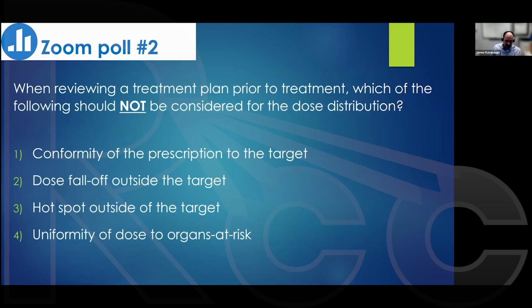So on this last case, I don't think I have the slide to show how we cleaned it up, but effectively we took that patient's right-sided high dose that we weren't achieving anyway, and we said, okay, well, we can't achieve that 6450. Let's try to get 58 Gy to it, still retracting it, but giving it a reasonable opt volume to push dose to. And that eliminated the hot spot outside. All right, we'll wait a couple more seconds to get your answers in.